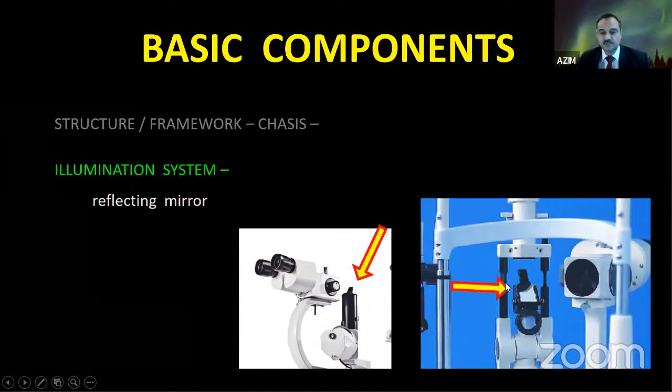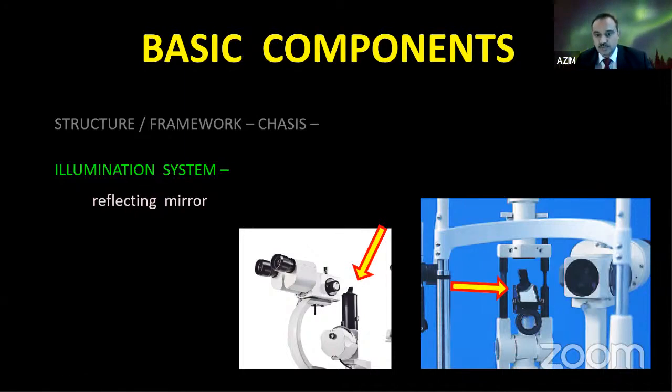They have two types, the bottom and the top. A point of note, the top one has a front coated mirror. Unlike the mirrors in your house, this mirror is coated in front, which means you should not wipe this mirror every day, as you're going to take out the coating. So remember, if it's dust, you should blow it. We should not wipe it with a rough cloth.